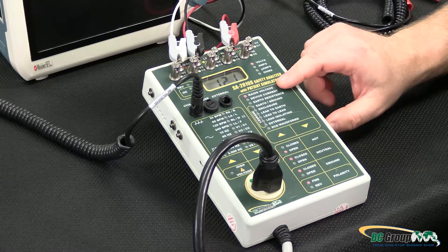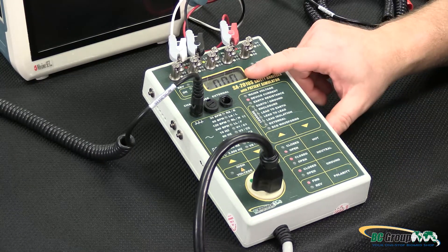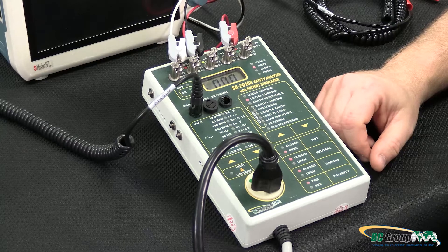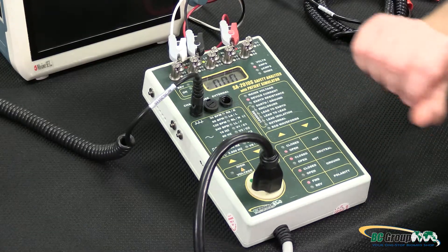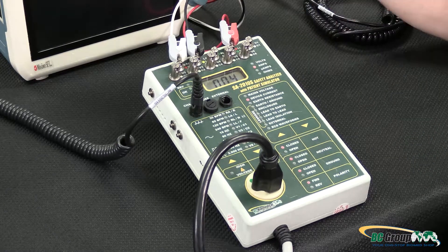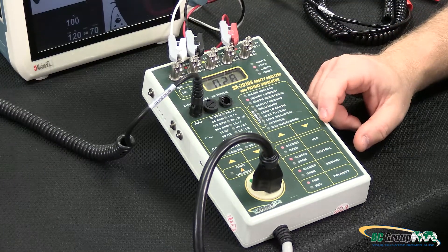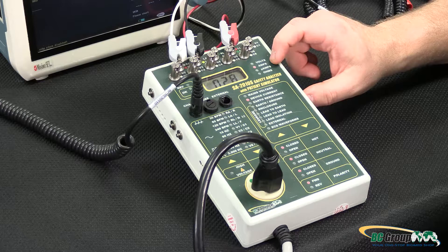We already did the mains voltage test, and now we can test the device current. We have zero amps displayed, and the indication for our test receptacle is down in this corner. The safety analyzer powers up in a safe condition where the hot terminal is open, as indicated by this LED. I'll close the hot terminal — now we can see a slight power measurement, and if I turn on the DUT that power measurement increases. We can see device current displayed in amps: we have 0.28, 0.3 amps on our DUT.